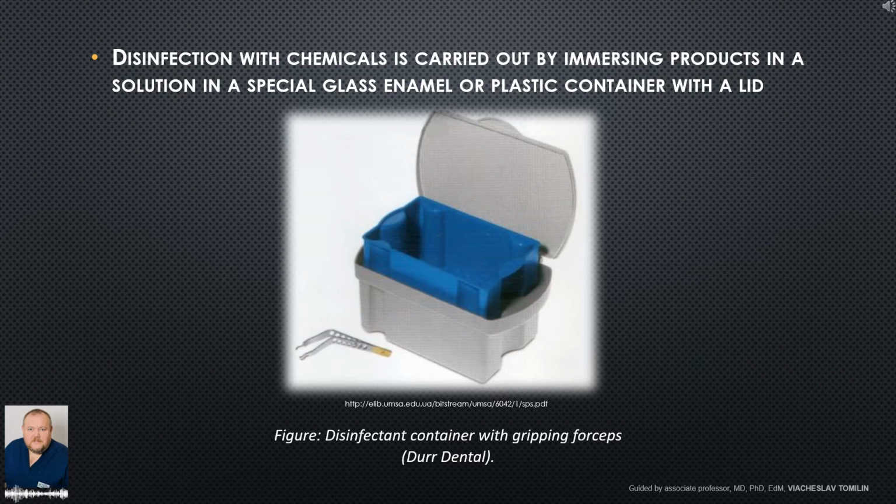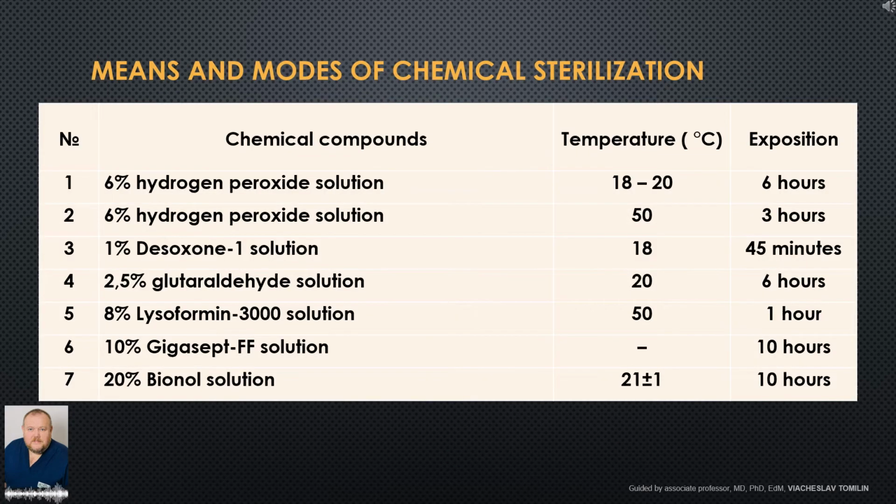Disinfection with chemicals is carried out by immersing products in a solution in a special glass, enamel or plastic container with a lid. A disinfectant container with dental gripping forceps is shown in the figure.